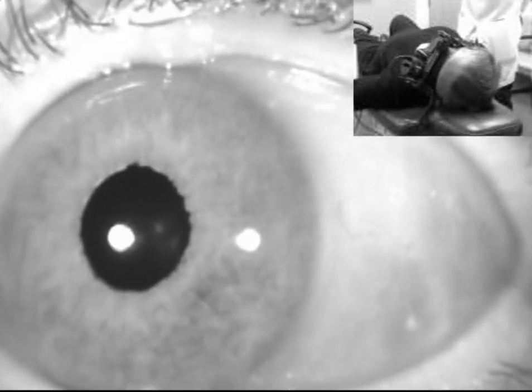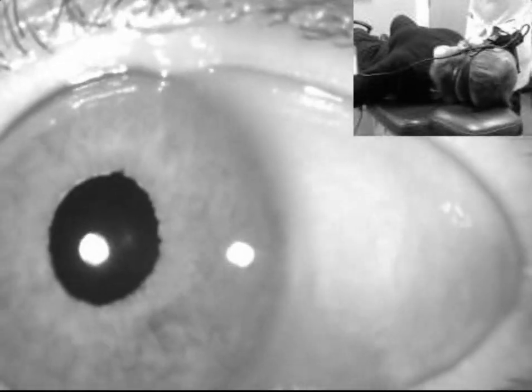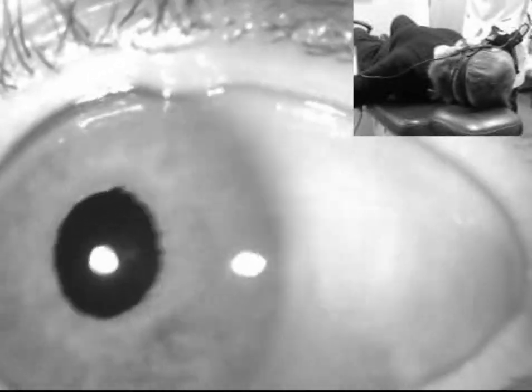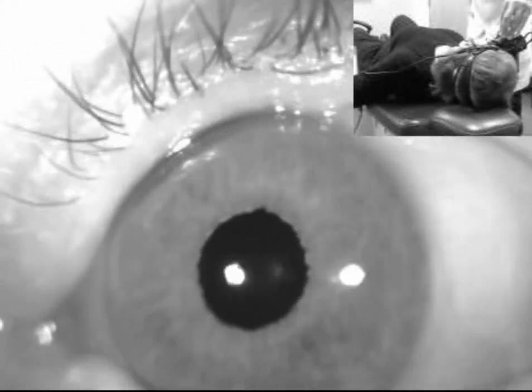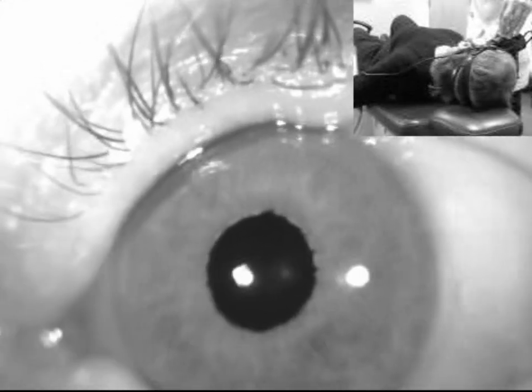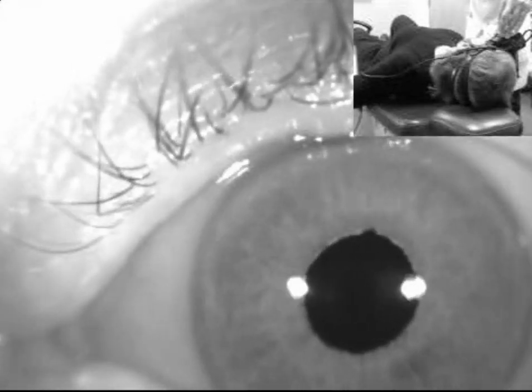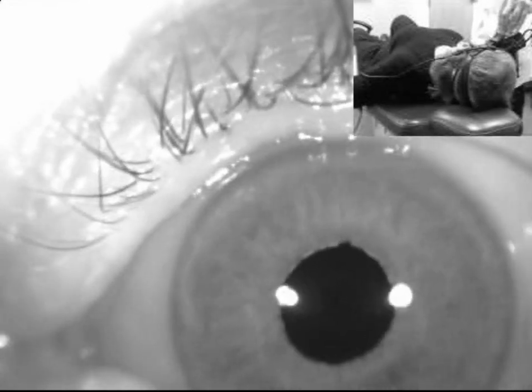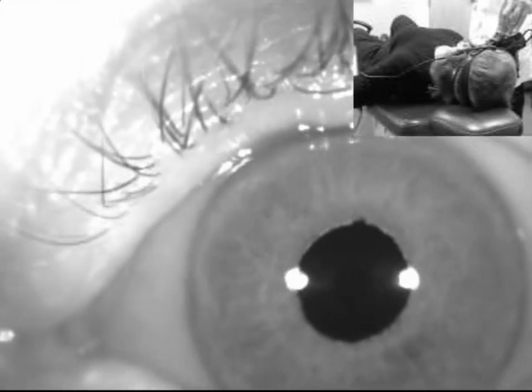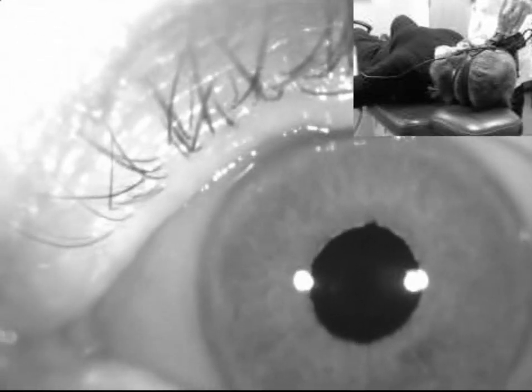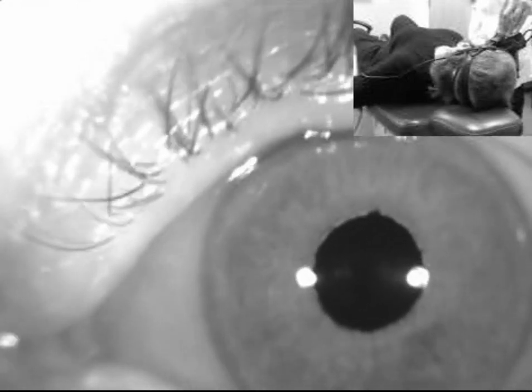Now turn your head back to the right, all the way over. And that is a very strong response. It is so strong that there's some double beating — the eye can't even reset before it goes back to the right. I think that the response on the right side may be stronger.